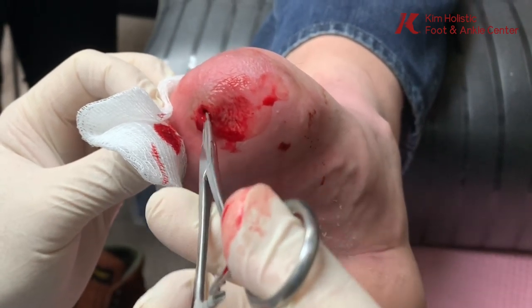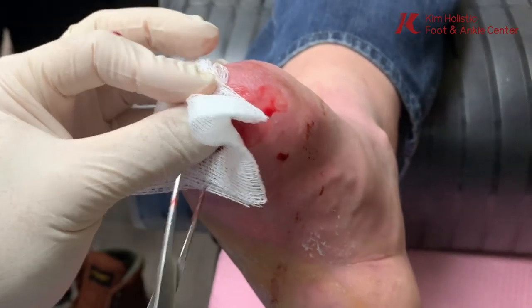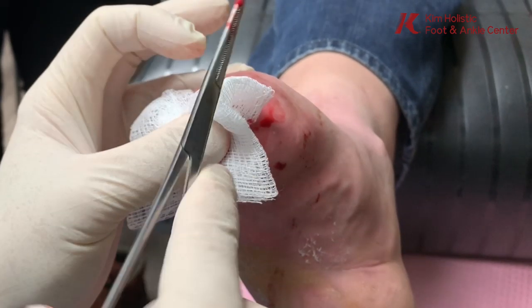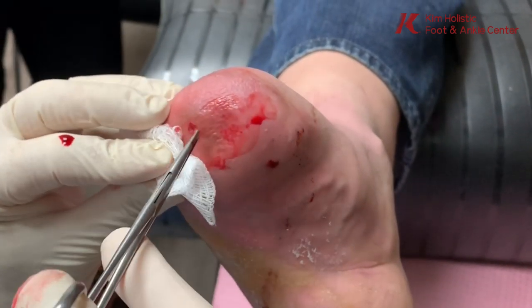Nothing's loose. This is that cyst case stuff, and we took a culture last time — it came back with no infection. So it's not an abscess in the traditional sense; it is a sterile abscess.